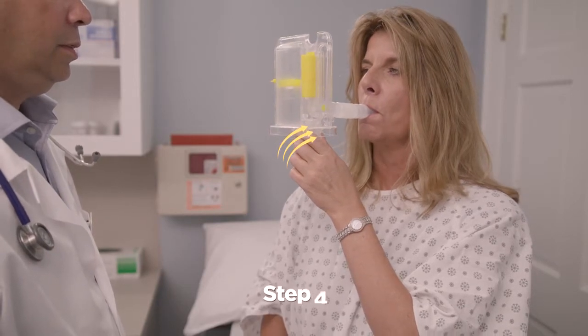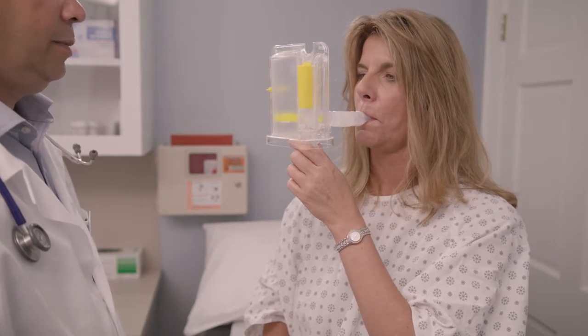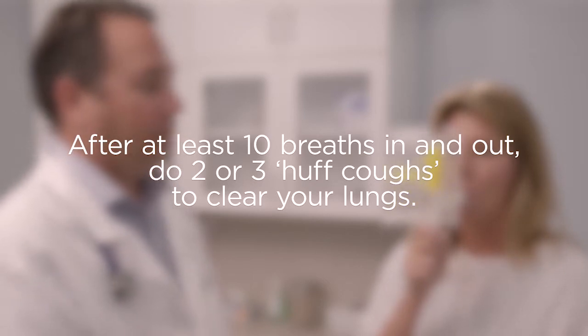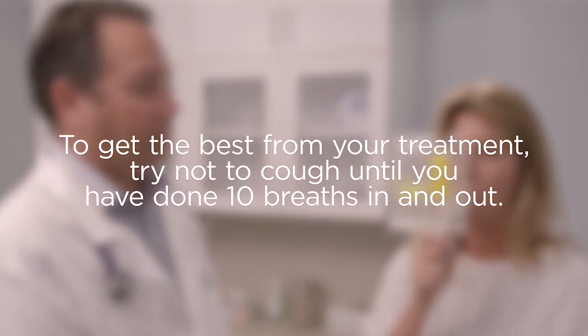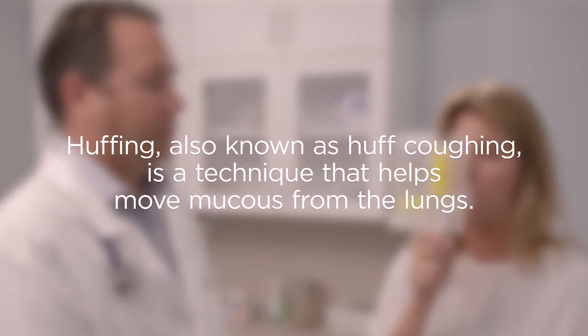Your healthcare practitioner may tell you the number of breaths they want you to take. After at least 10 breaths in and out, do two or three huff coughs to clear your lungs. To get the best from your treatment, try not to cough until you have done 10 breaths in and out. Huffing, also known as huff coughing, is a technique that helps move mucus from the lungs.